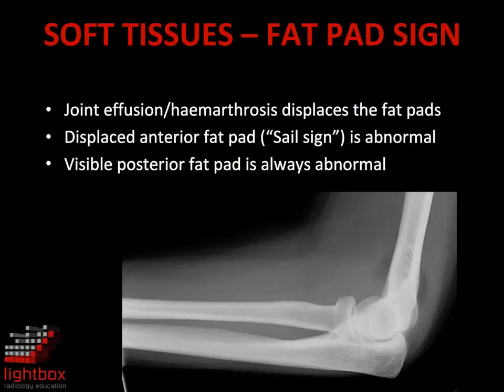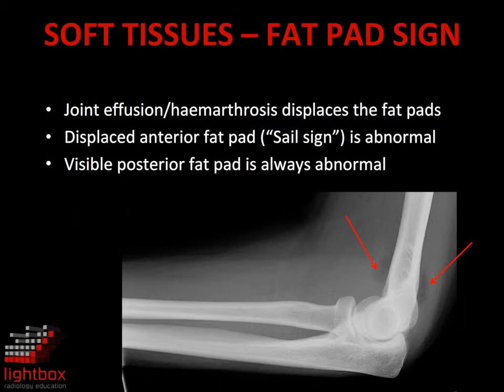Once the bones have been assessed, the soft tissues need to be evaluated to complete x-ray interpretation. Signs of a joint effusion or haemarthrosis are elevation of the anterior fat pad and visualisation of the posterior fat pad. The anterior fat pad is usually closely applied to the anterior cortex of the distal humerus. Elevation of the anterior fat pad is referred to as the sail sign, where the fat pad has the appearance of a mainsail on a yacht. The posterior fat pad should not be visualised in a normal radiograph, and its presence is diagnostic of a joint effusion or haemarthrosis.